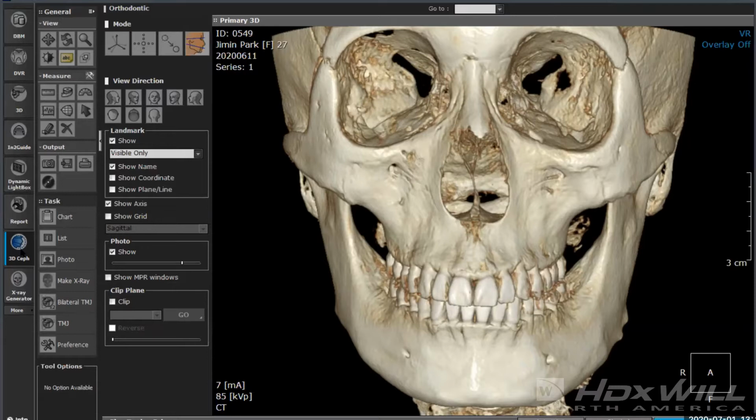As the world starts to evolve and understand the 3D evaluation of orthodontics, we're going to find out where in that sella turcica we want to be. Do we want to be in the middle of the saddle, off to the side? It helps us start making even more critical and more accurate measurements because we can see it in 3 dimensions.